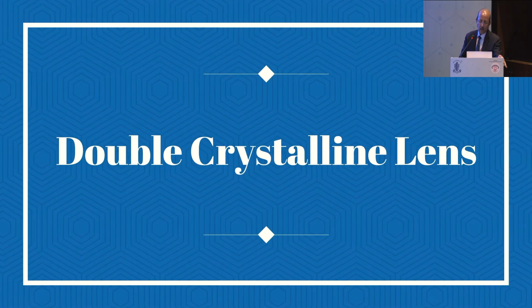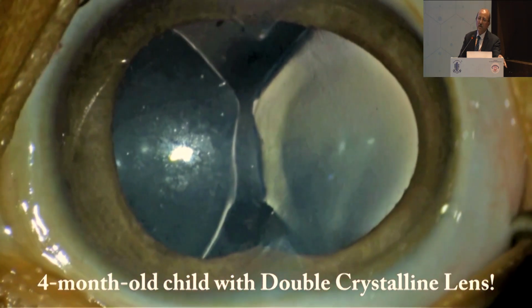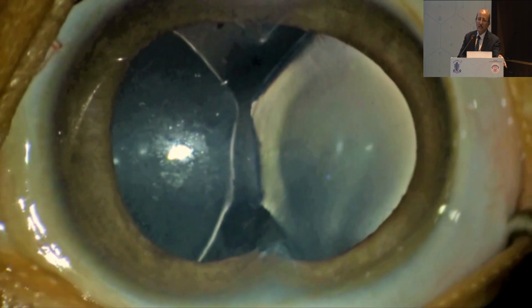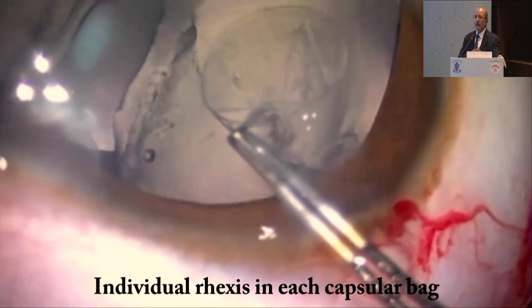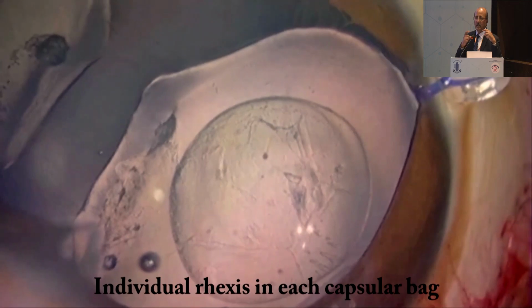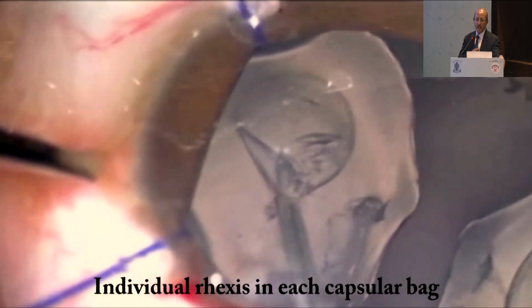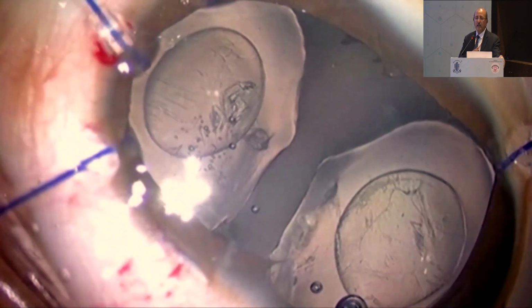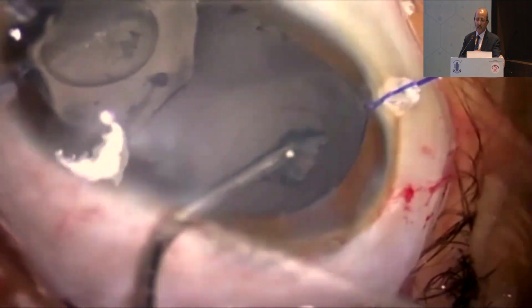So here is this third child with double crystalline lens. I think you must have seen this video at many places. This is a child who had united cornea, two corneas joined together. There was a junction in the center, and there were two crystalline lenses. They were separate crystalline lenses, and we planned a customized IOL for this child.